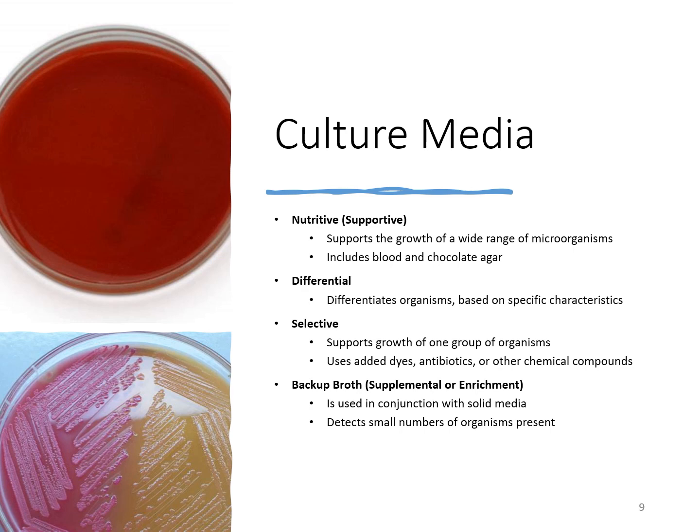It helps to enhance the growth of those small numbers of organisms. Sometimes something like this may be set up on a vaginal culture, for example, which would allow for enhanced growth of those organisms, and then that broth itself can also be cultured or gram stained as well.